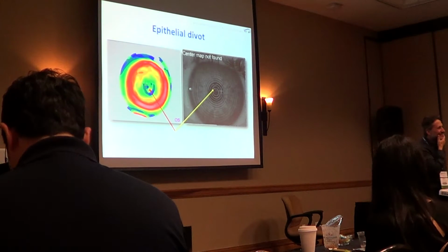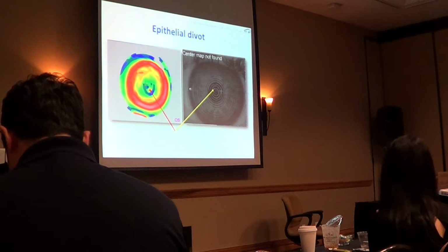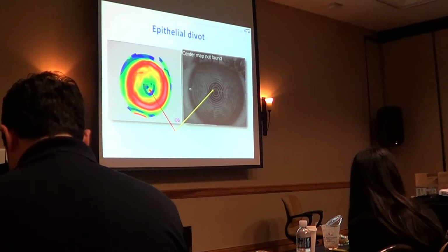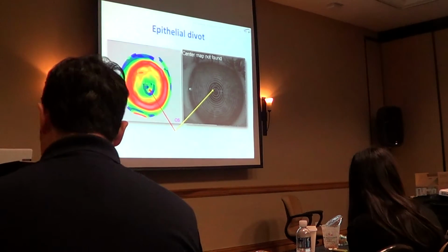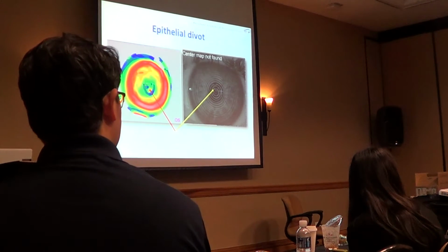Sorry, by the way, it's the way we do with trial sets. When you change one lens from a trial set one step, you are changing all the curves one step. So it's the easy way. Then you could move to do a tuning.